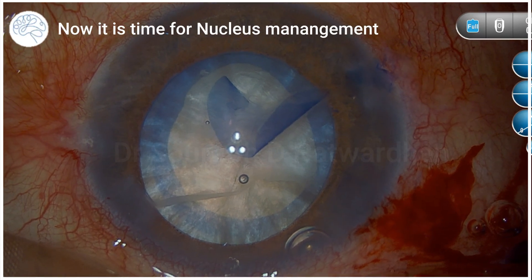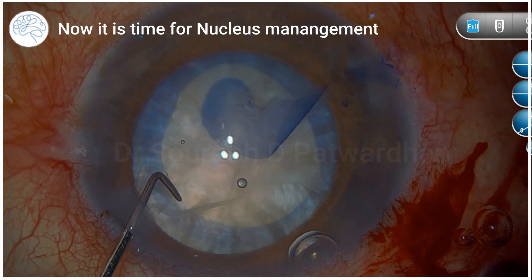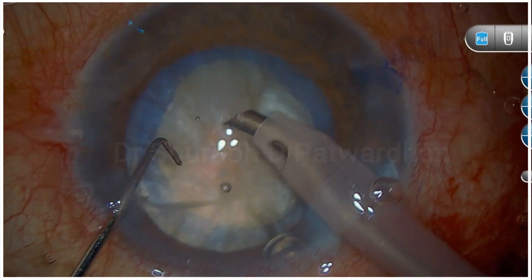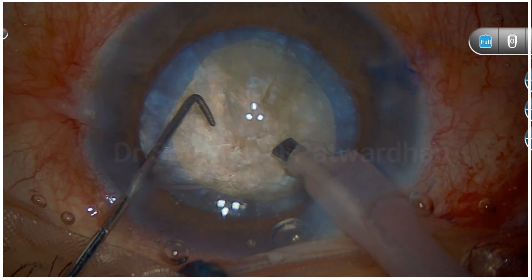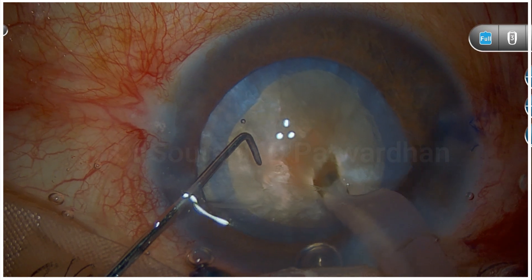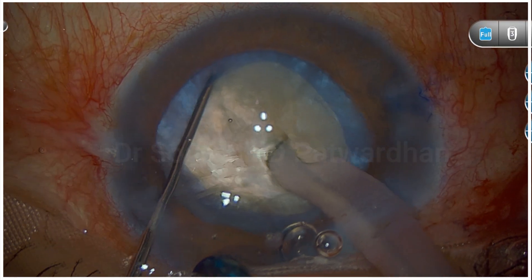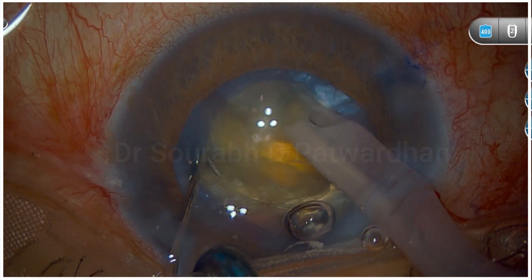Once the capsulorrhexis is done, it's time to think about nucleus management. It's an intumescent cataract but an old patient, so the surgeon should expect a hard nucleus — and that's what it is. The anterior nucleus was cleaned up here; I would say it should have been cleaned a little bit more for better visualization, particularly for depth. The surgeon is planning to do a deep trench and I would advise making a longer and deeper trench, then try to divide by chopping at the end — but you can see the division is not complete.